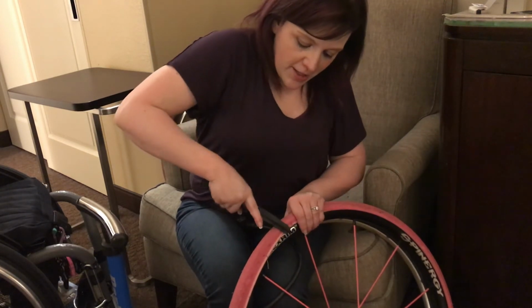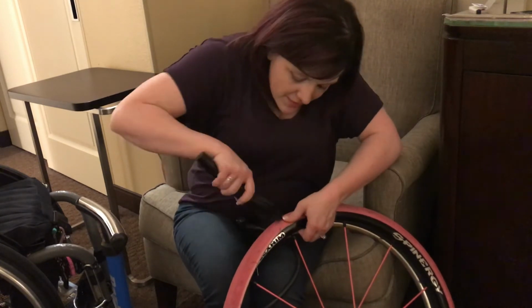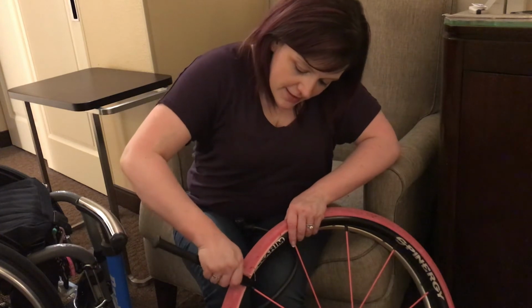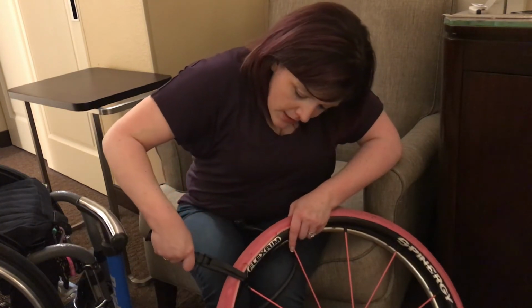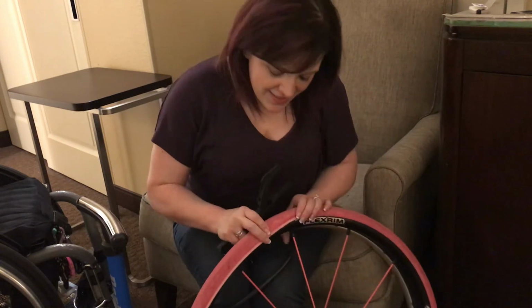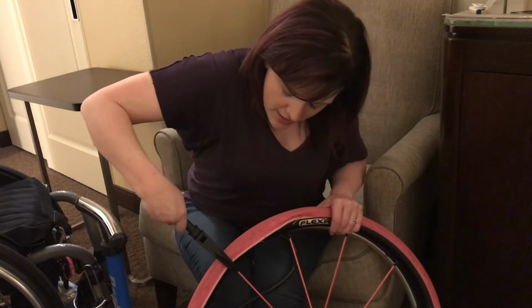You want to make sure you have a good grip so it can actually help. It's kind of not working. So when it gets too close, and you can't really, yeah, you'll notice this stops working once you don't really have as much to grab onto, so you want to work your way further down the wheel, or down the tire, I mean.